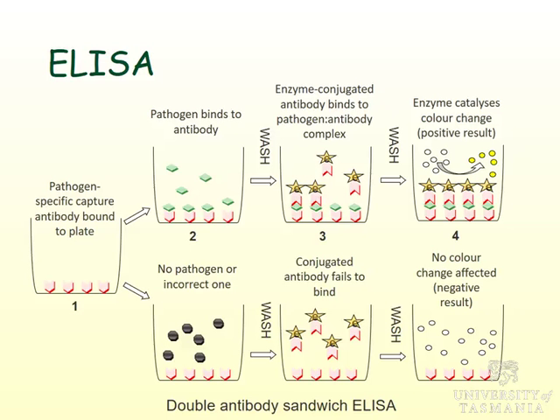So, it's specific, it's quite sensitive because it's actually an enzyme reaction, so it actually increases with time. So even at very low concentrations, if you leave it long enough, that enzyme will continually catalyse that reaction, and you'll get a bright green, a bright yellow result. So it might take half an hour, it might take half a day, but you'll actually amplify the presence of that pathogen, and so it's quite sensitive.